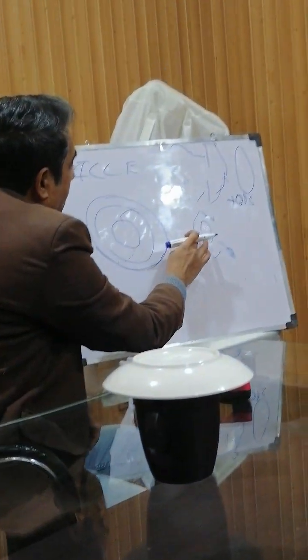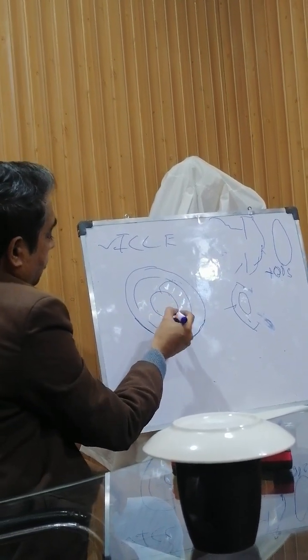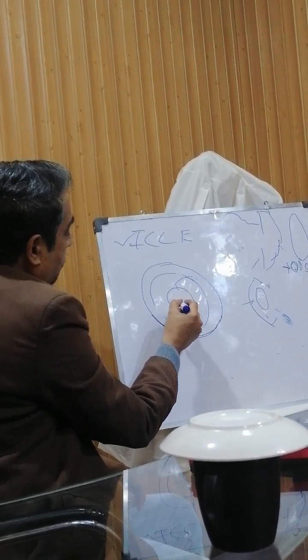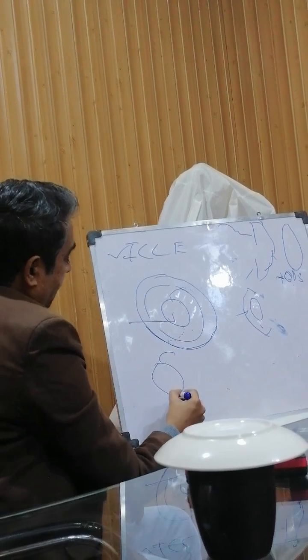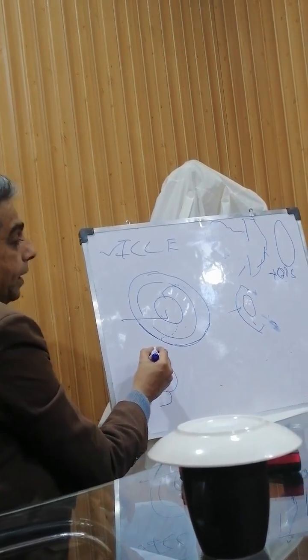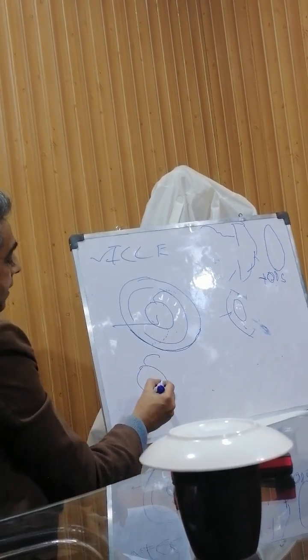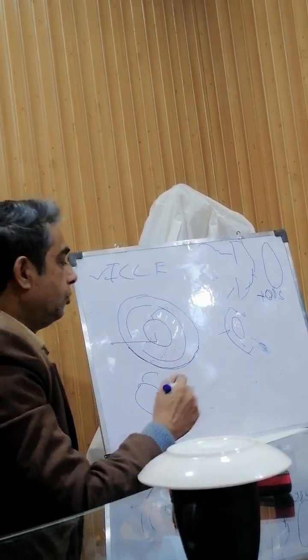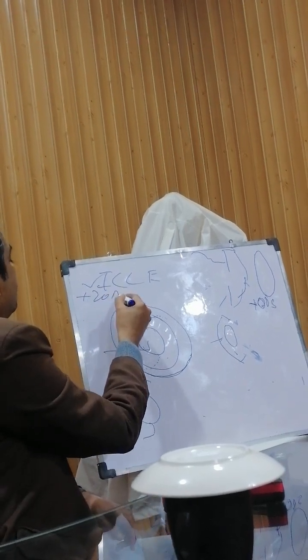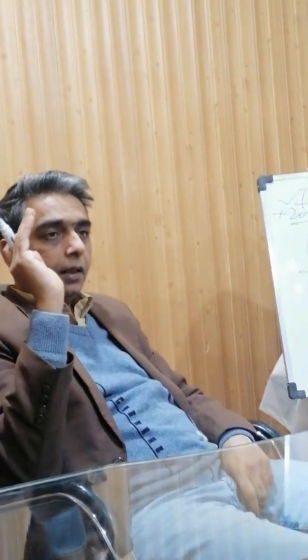So posterior capsule is to be retained, and this is the lens. It has got three parts, two parts you can see. This is the central part, which is called optic, and these are the two. If I draw it here like this, these are two hinges, called haptics. These engage the lens into the position, and this is the optic of the lens through which the rays of light converge. This is usually plus 20 diopter spherical. But for this we do a test which is called biometry. The machine is present in the OPD.